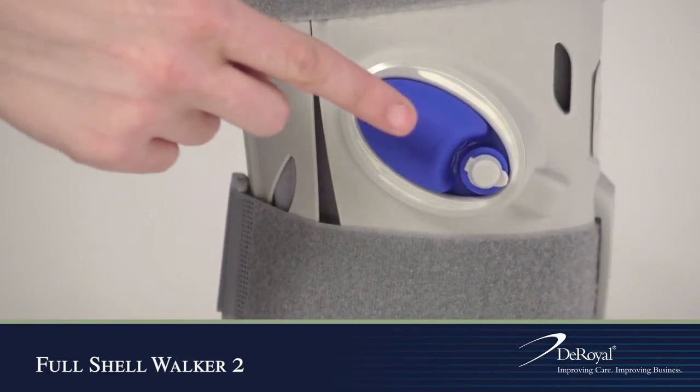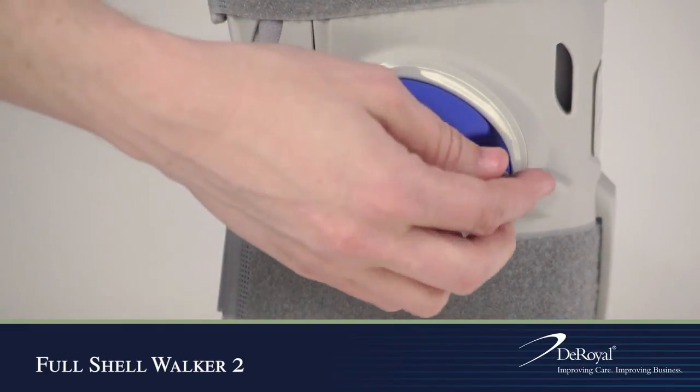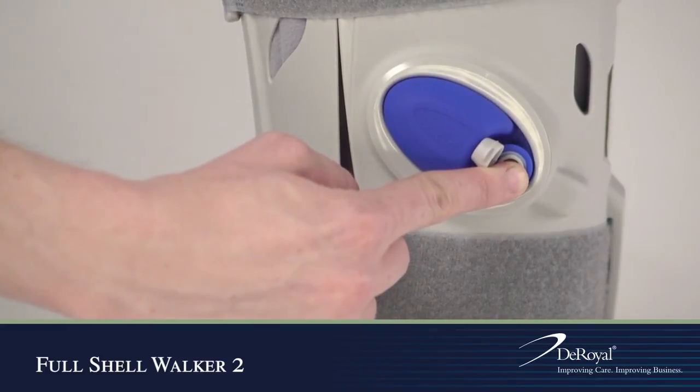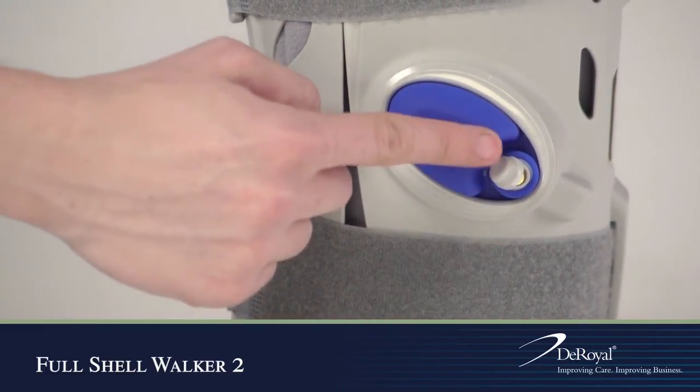To deflate the air bladders, open the cap of the smaller button next to the bulbs, push the button to release the air, and reapply air pressure as needed.